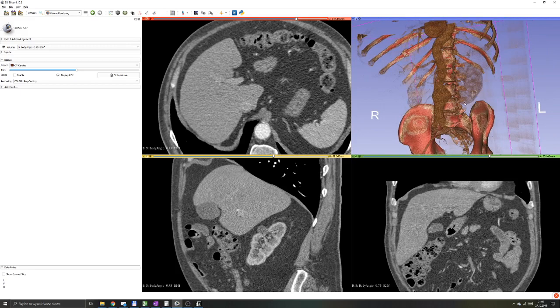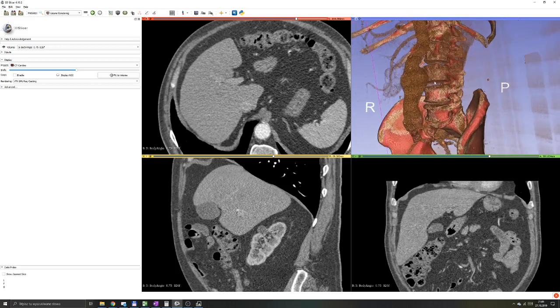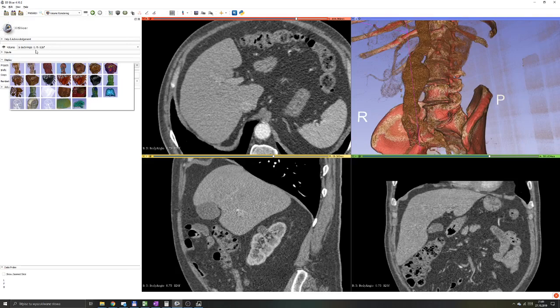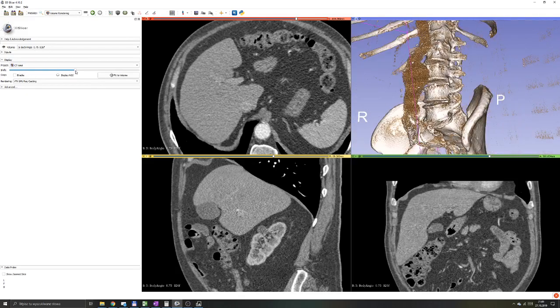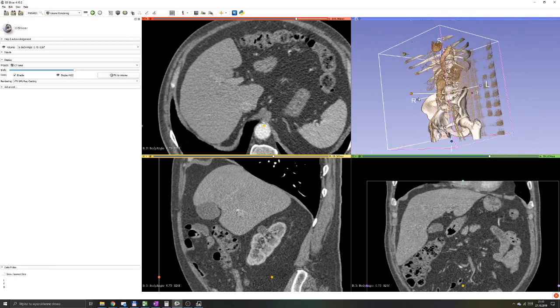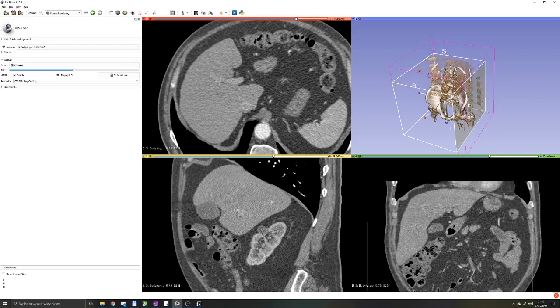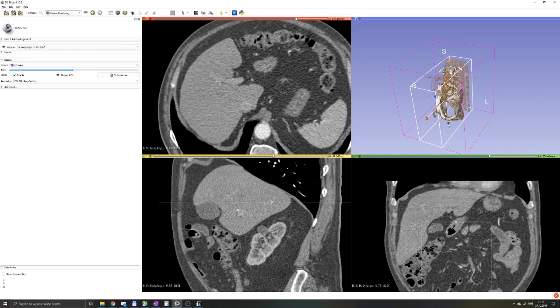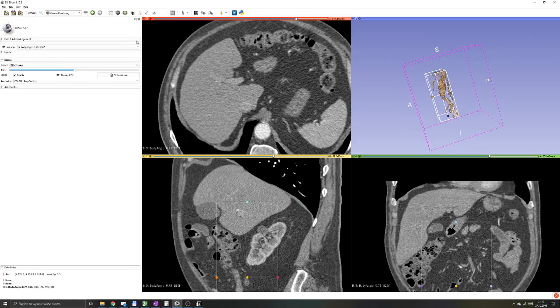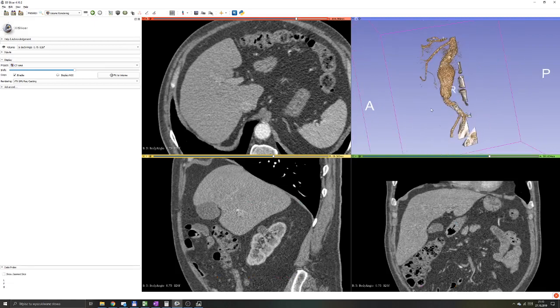Volume rendering is often used by radiologists to give a quick preview, because it's very easy to make a screenshot of an aneurysm by just making a volume rendering. You just choose the preset you're interested in. You can even clip the image by enabling the crop option and, as I'm doing right now, limit the volume rendering to whatever area you're interested in. Then you can make a screenshot and send it to your surgeon.